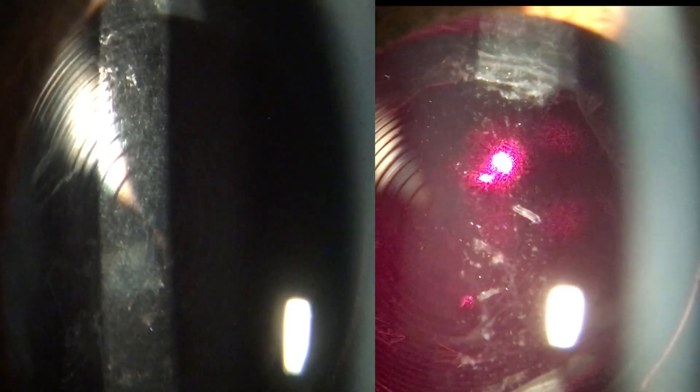Here you can see a side-by-side view: the clouded capsule on screen left and the open capsule on screen right. This patient did great and their cloudy vision was significantly improved. Thank you for your time and attention.